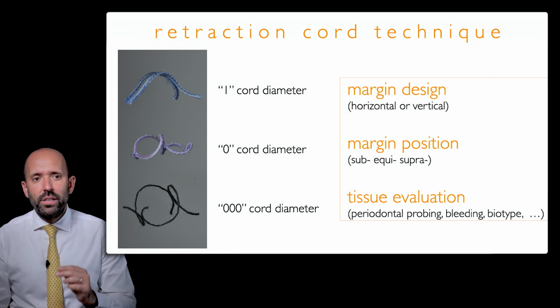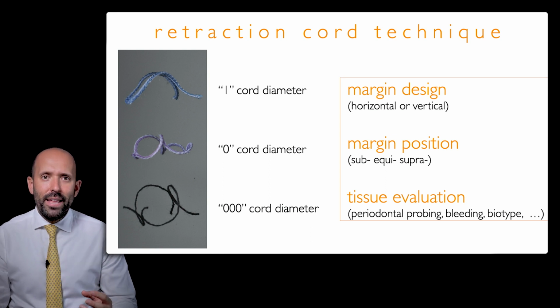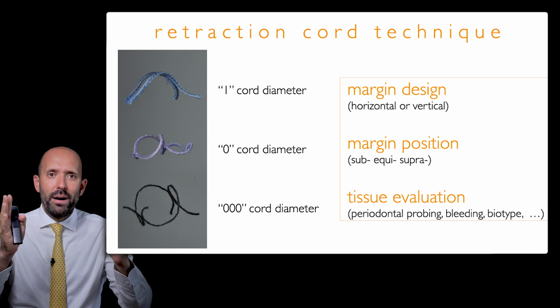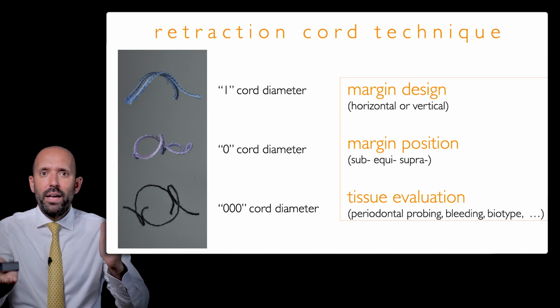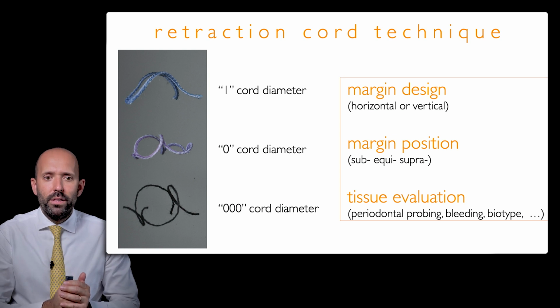The selection of these types of chord is influenced in my practice when I take the impression by the margin design. So if I have a horizontal preparation or a vertical preparation, so with two different margin areas, I will have different criteria. To margin position, if I have an extremely subgingival margin or if I have an equigingival margin, my approach, as we will see, will be different.